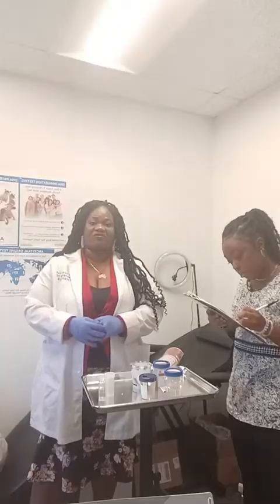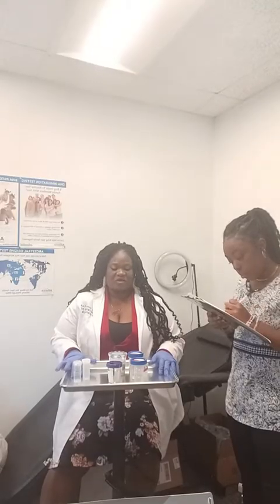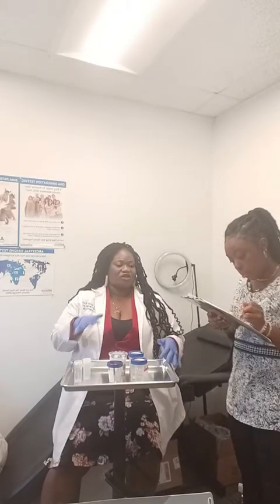She didn't refuse to sign at this point. So again, everything is uneventful. She was able to sign. She wants to sign. I told her to sign, and she signed. So we have uneventful. She's putting the information in step 5. That's where the donor's information goes. Step 5. All right. Thank you very much.